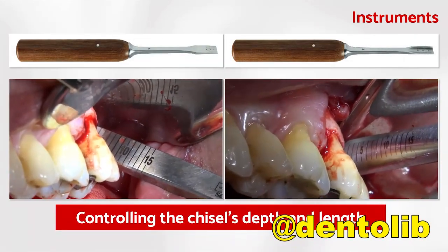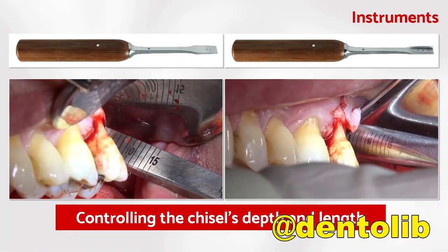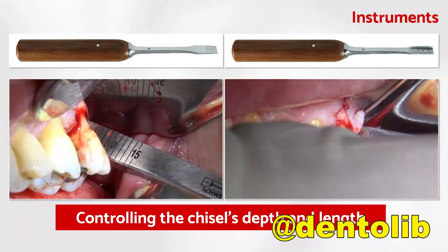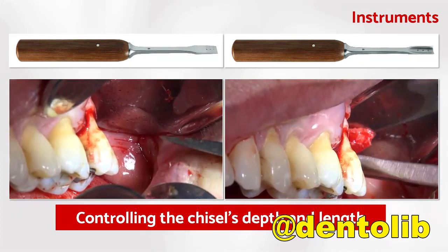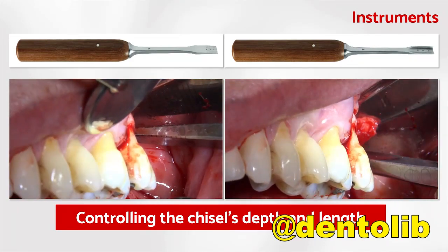We can also control the chisel's depth and length when we see these laser marks on both sides, in the front and in the back of this tool. All of them, the straight one and the curved one, have these special marks.